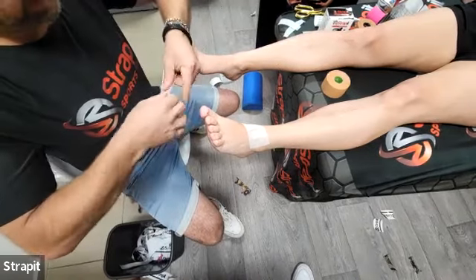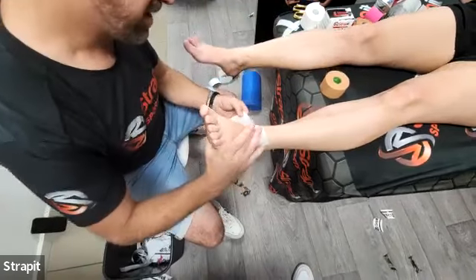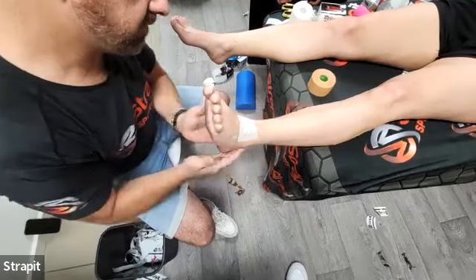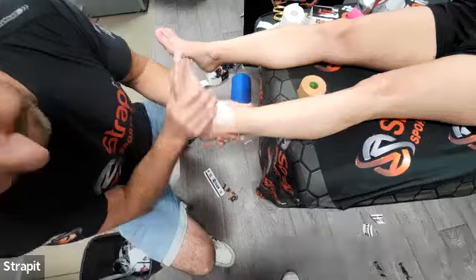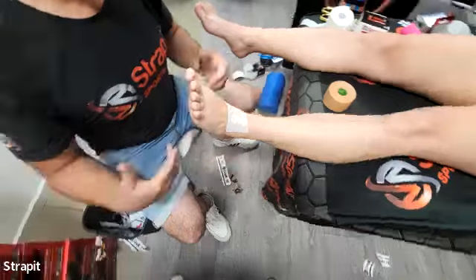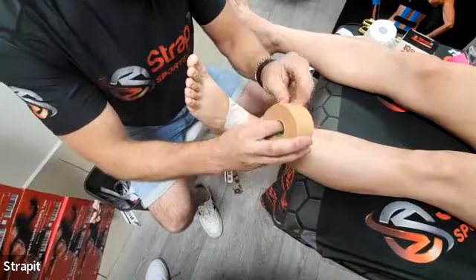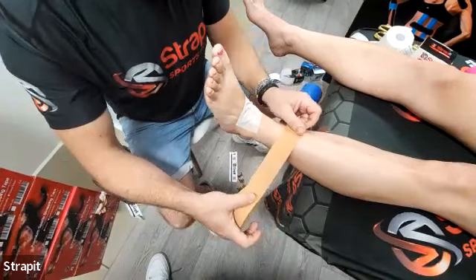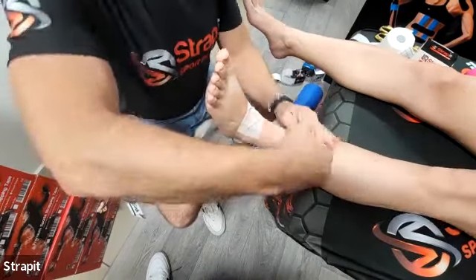So I might use this posteriorly for the Achilles as well. Tash, go into dorsiflexion here. So we put her in plantigrade and lay the tape down. We've got the tape under there. Again, if you've got real sensitivity and a latex-based adhesive, you may tape the whole foot as a prep. Now, rigid tape — this is one of the most commonly taped joints of the body, so I apologise for those who are very experienced, but I'll just go through this.